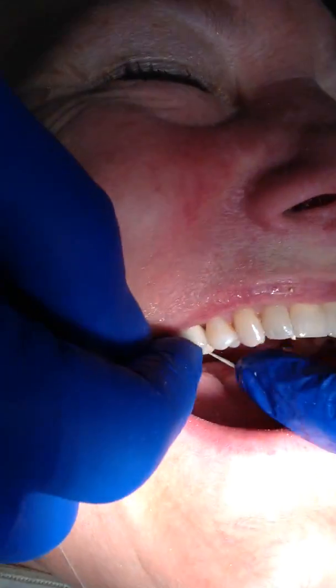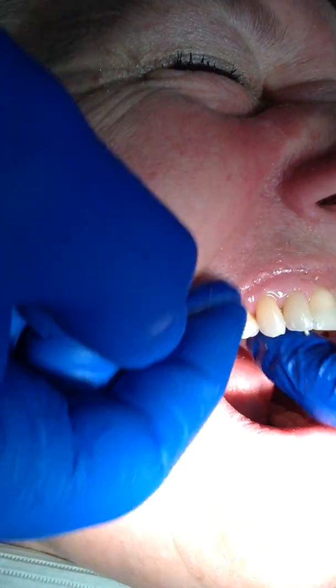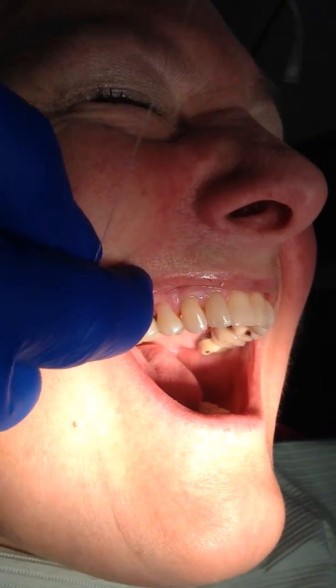We are going to come in and floss the contacts, but you'll notice there's absolutely no overhang there — no overhang there. And a very nice end result.